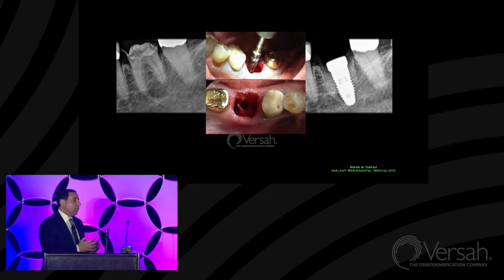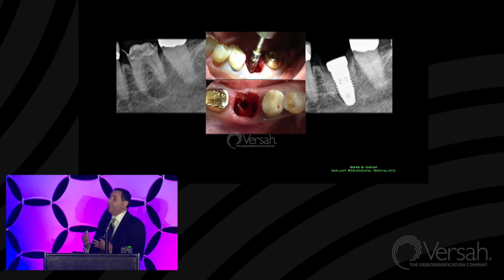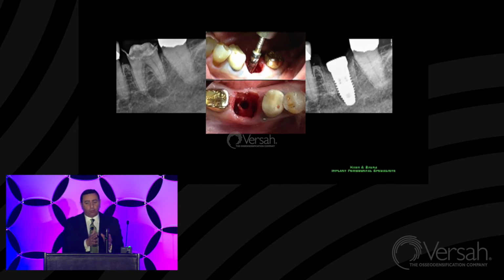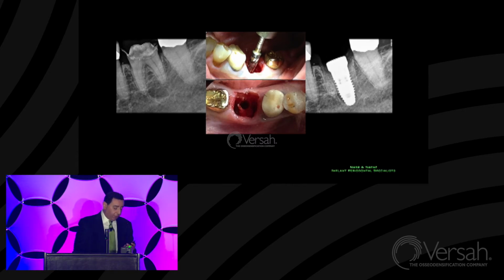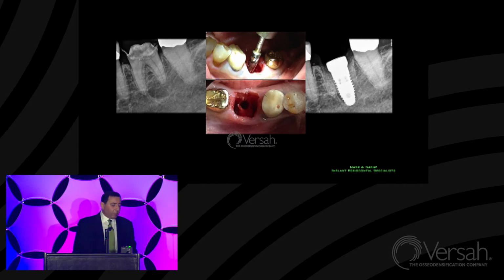So how about we don't cut away bone at all? How about we push the bone? How about we densify the bone? And you can literally see that bifurcation ridge or trifurcation ridge of bone expanding into the socket spaces, mesiodistally in the mandibular molar, and in all the trifurcation, palatally, buccally, mesiobuccal and distobuccal on maxillary molars. So I find that this is a great application. It actually makes the surgery a lot less cumbersome, and it's one of the nice things that I thought works quite well.